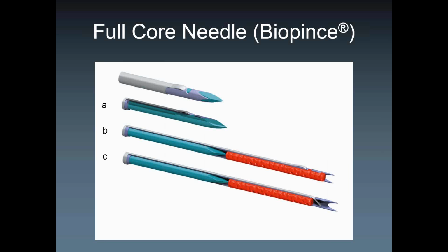But if you have a pretty dry target for whatever reason, let's say a lung, for example, you may sometimes end up not having tissue because this mechanism here doesn't work. Maybe the blade just gets stuck outside, or it just runs across that slit and ends up in here. You don't know exactly because it's so small you hardly see it, okay?